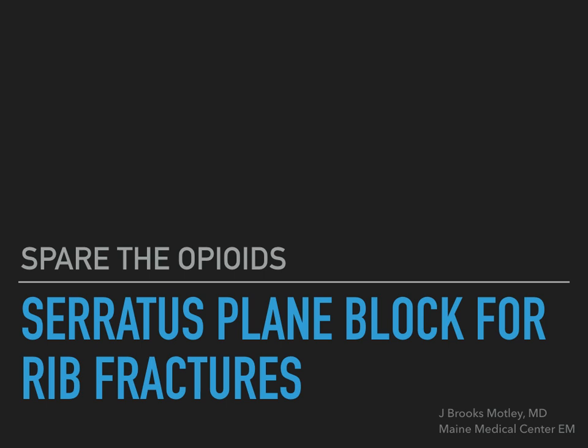I want to share with you an opioid sparing technique for rib fractures called the Serratus plane block. This video is meant to be a brief introduction to the Serratus plane block, an ultrasound guided volume block in the chest wall to be used for pain control. We've started using this block in the ED at Maine Medical Center for rib fractures, but there are certainly other possible applications where anesthesia of this region is desired.